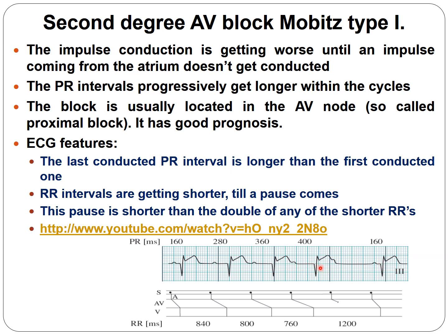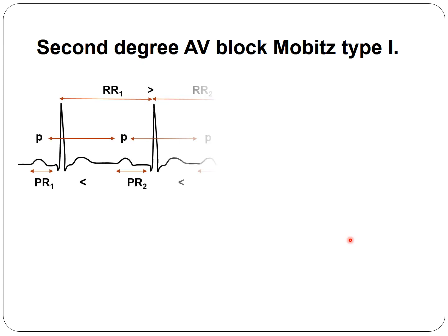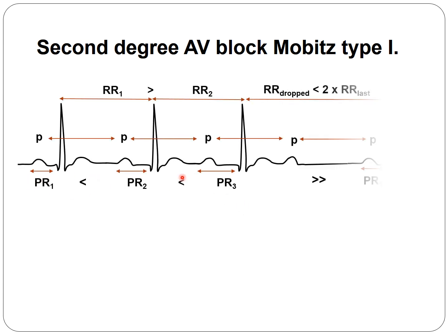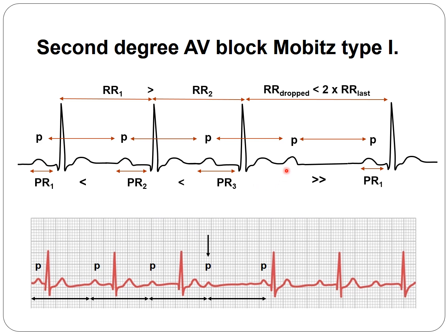You can see the difference between the last and first conducted PR intervals — the last one is longer than the first, representing Mobitz Type 1 second degree AV block. The pause is shorter than twice the last RR interval. To summarize: the PR gets longer and longer, then a beat is dropped, and after that the cycle restarts with a shorter PR. The dropped RR interval is less than twice the last RR interval — this is how we differentiate Mobitz Type 1.